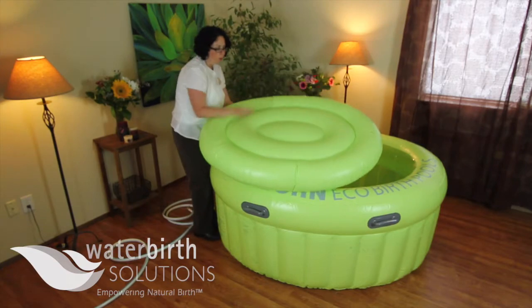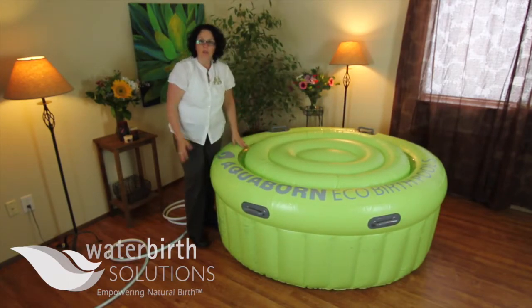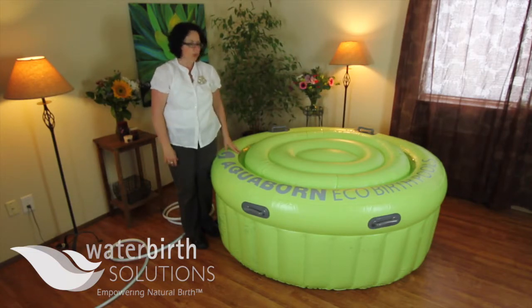This is what a completed Aqua Born pool looks like, including the lid — the lid just sits right on top. So if you fill your pool with hot water and you want to keep the temperature in, go ahead and use your lid.